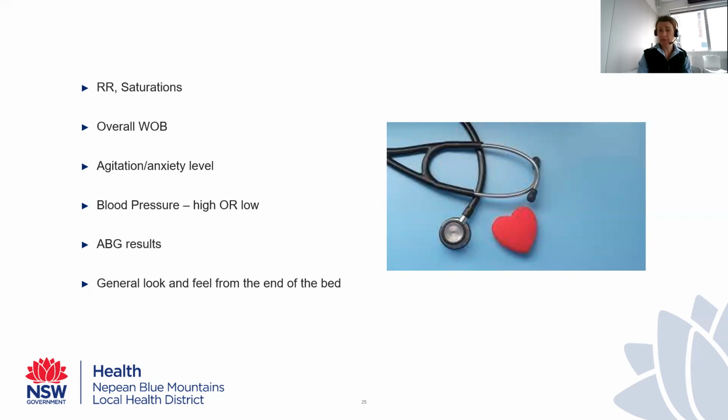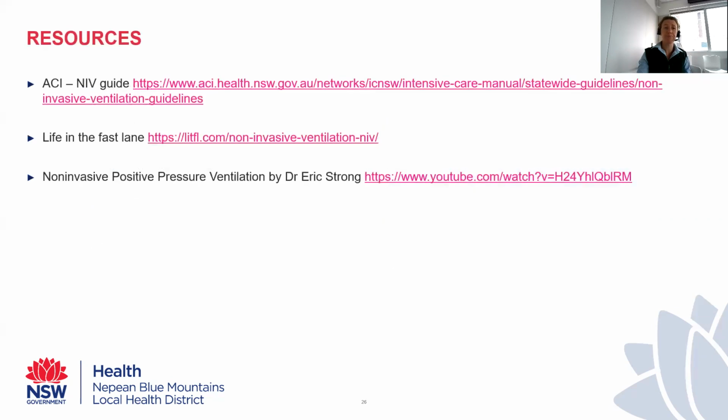ABG results, we don't always have them, but they can be helpful. But again, it's often not first line. We need to go off clinical assessment. We shouldn't be waiting for ABG results to necessarily determine response, particularly in our COVID patients. Their numbers often look dreadful. We really want to see how are they going from the end of the bed? How's their work of breathing? How are they feeling within themselves?